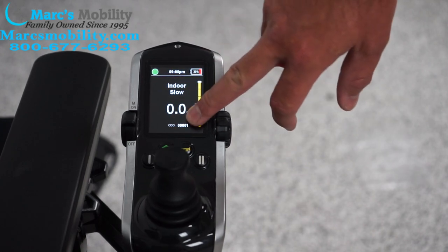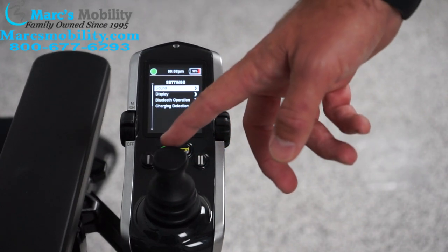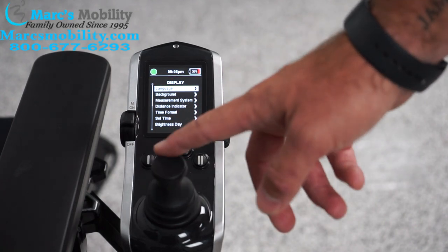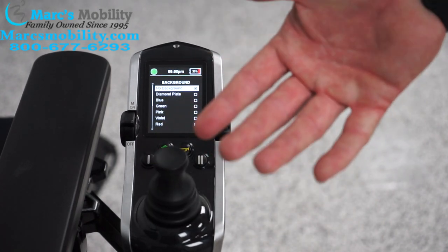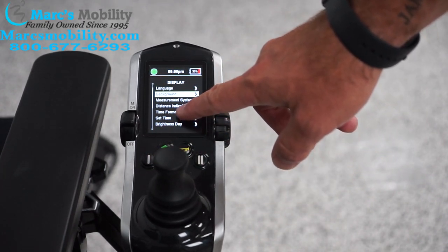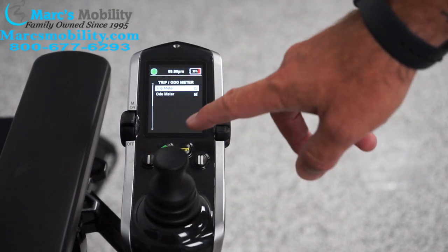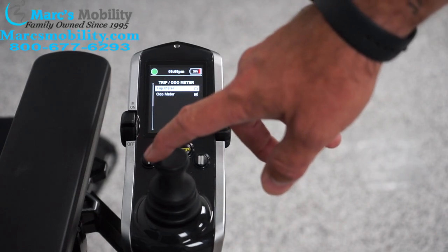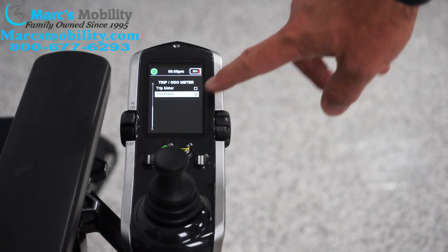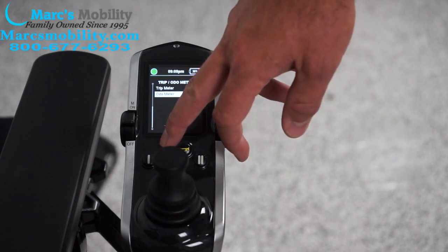To change from trip to odometer, hit the home key, go to the settings by going left, then go down to display. You can actually change your background color on the main display to different colors. What I'm looking for is distance indicator — if you go down to distance indicator it says trip or odometer. Right now odometer is checked; if I push right on trip, trip becomes checked. This is simply how you change it from one setting to the other.